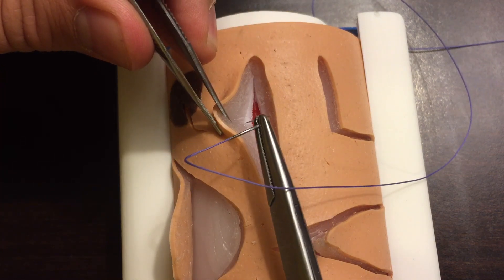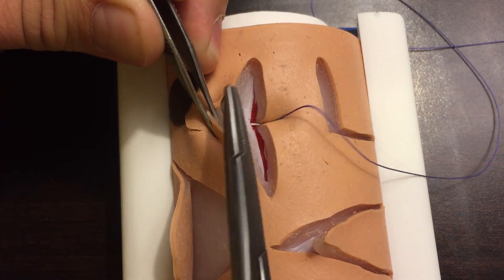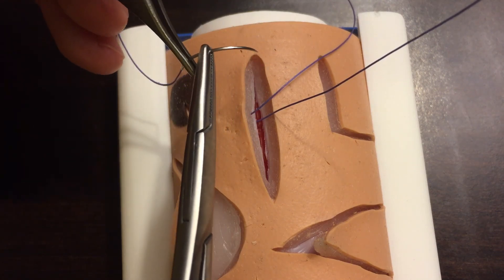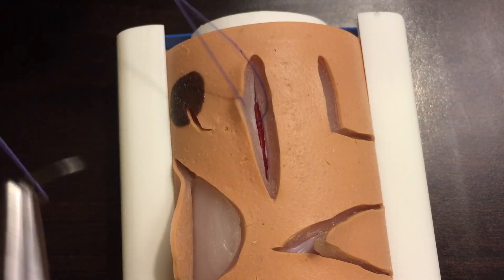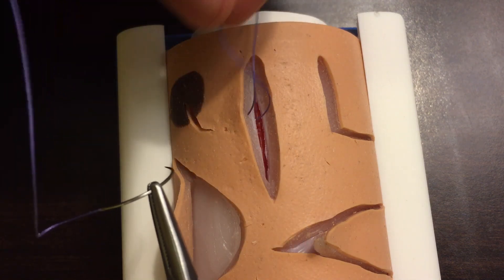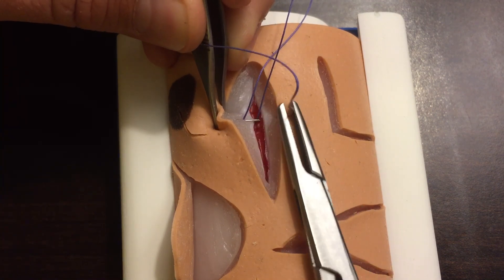Instead of grabbing over here on the right side first, we're going to grab on the left but from underneath. So we're going to come up through the tissue like this. I'll grab my needle there and pull it through — notice how my first throw is deep. Then on the other side, I'm going to load my needle backhanded, holding it in a way that I can hit this other side at a downward direction. So we go from bottom to top and then top to bottom, so that both tails of vicryl in the end are deep to the fascia. I'll go straight across and exit in the middle.